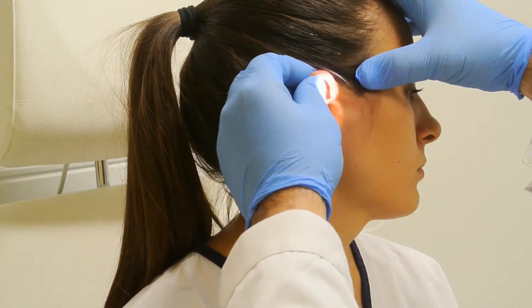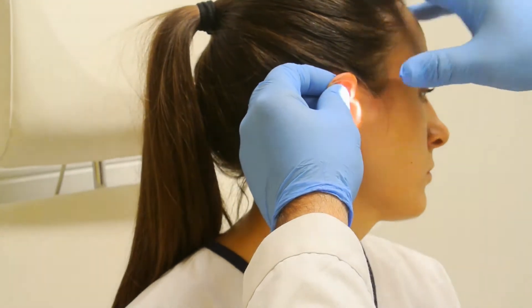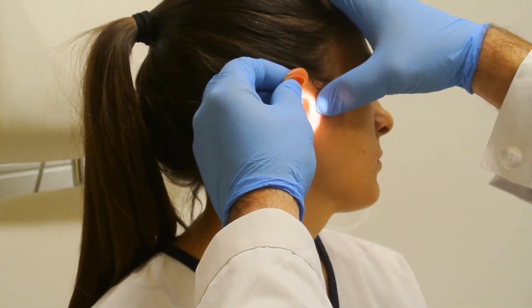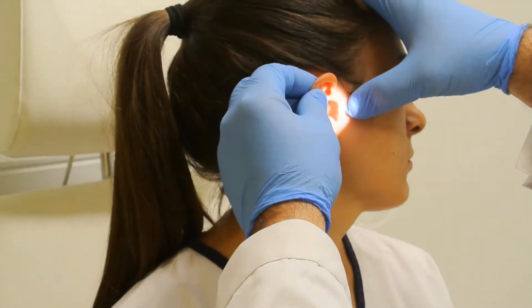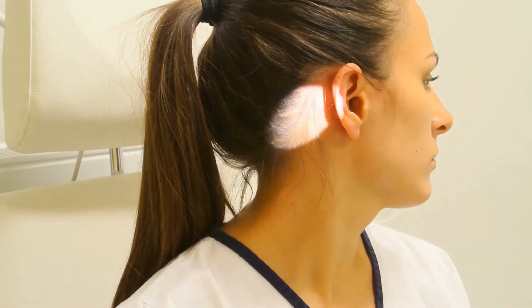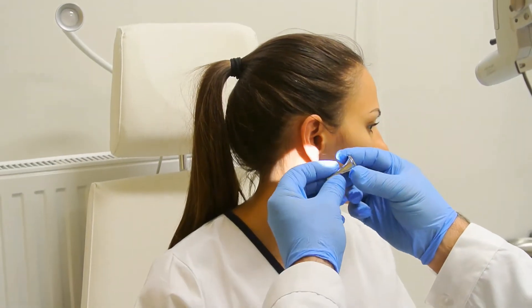It is important to check the orifice of the external ear canal, as lesions can occur there and cause infections such as folliculitis.